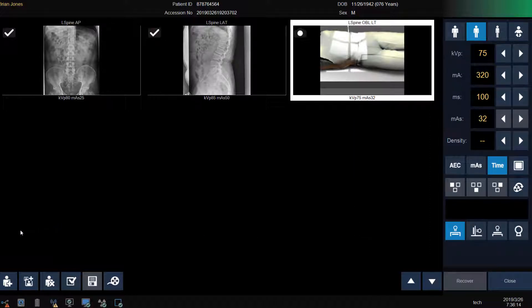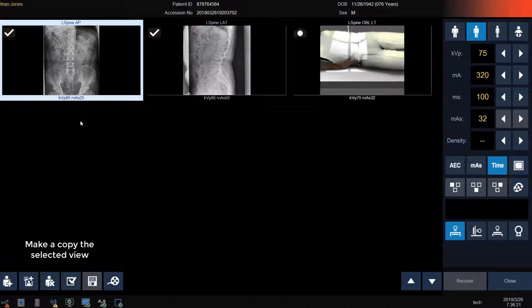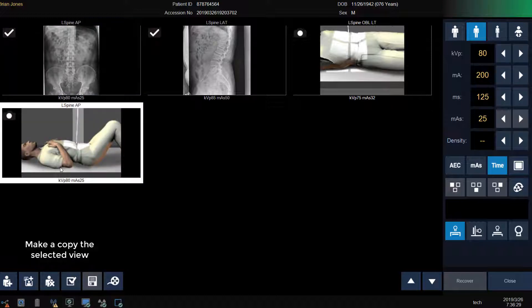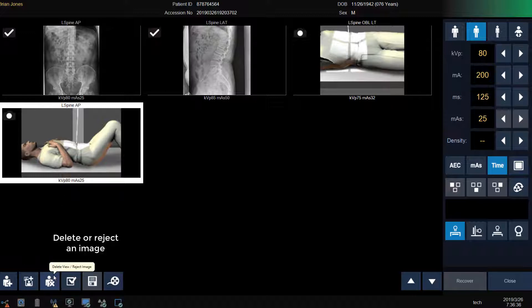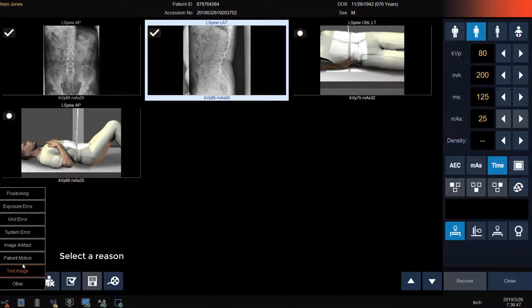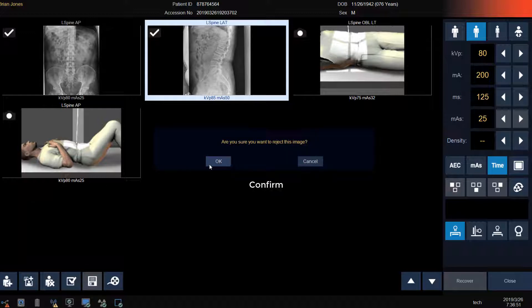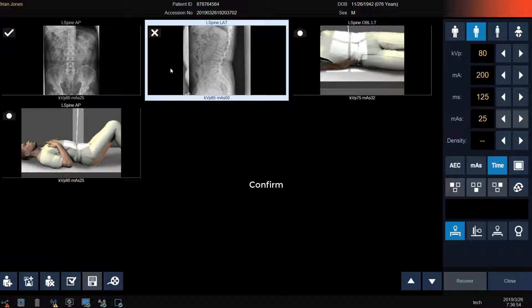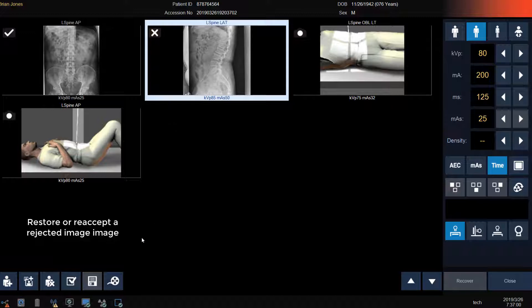If I want to make a copy of a view that I've already performed, I can click on the image and then click on the two image icon with the plus, and now I've created an additional AP lumbar spine view. If I want to delete a view or reject an image that I don't want to send to PACS, click on the image and then click on the man with the X icon. Now I can enter a reject reason and confirm. If I decide that I want that image later, I can re-accept it by clicking on the image and then clicking on the icon with the check mark to restore or re-accept the rejected image and send it to PACS.